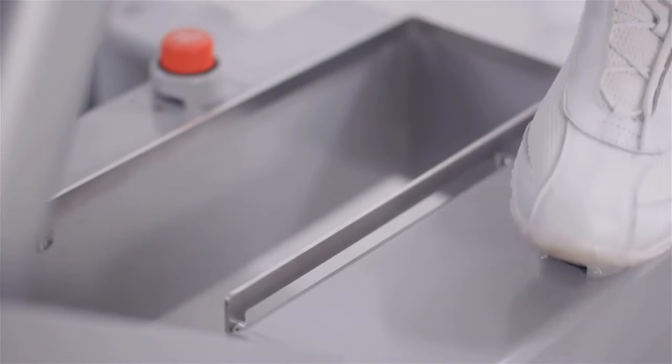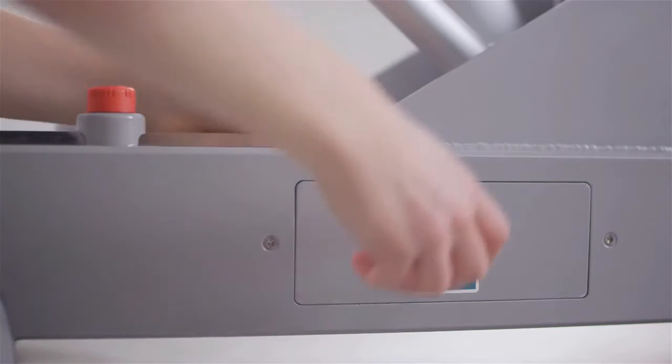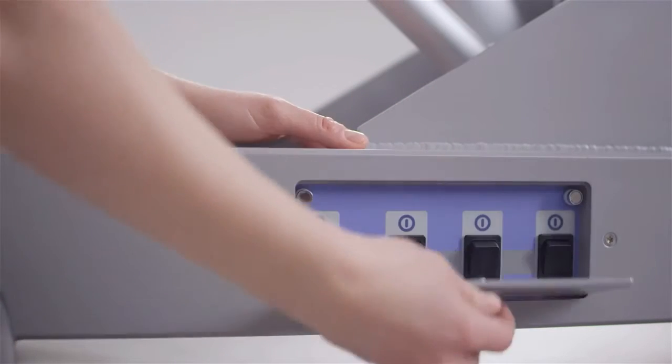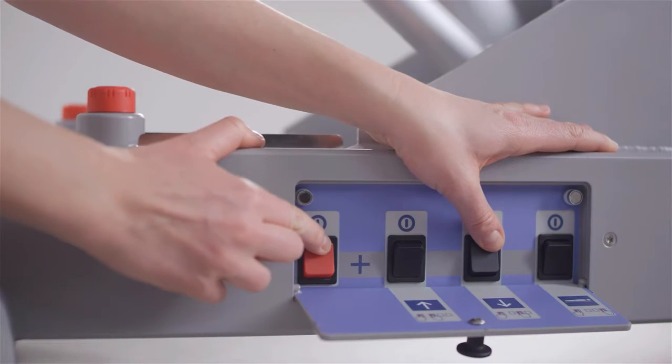Press one of the emergency stop buttons to halt operation. Reset the button by rotating it. This is the emergency function box. Press the main power switch and at the same time one of the following buttons.